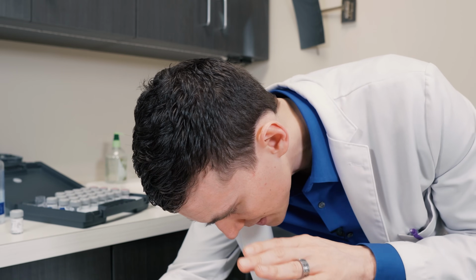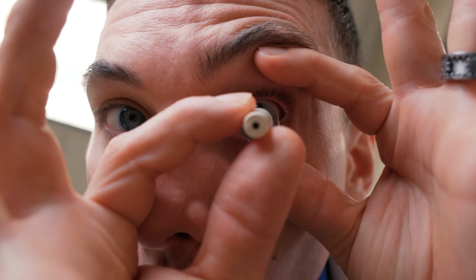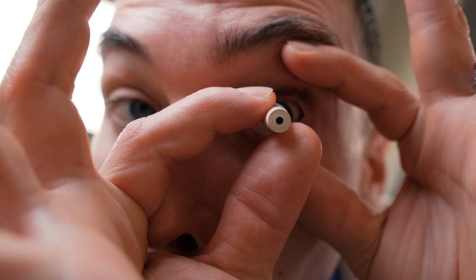But again, you want to be facing down and parallel to the floor. That way you don't spill the fluid out of the scleral lens when you're trying to put it in. Now, most people find it easiest to hold the scleral lens in one hand while using the other hand to hold both eyelids open as you're putting the lens onto the eye.